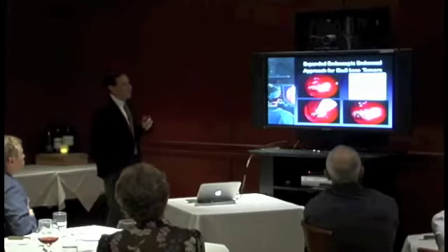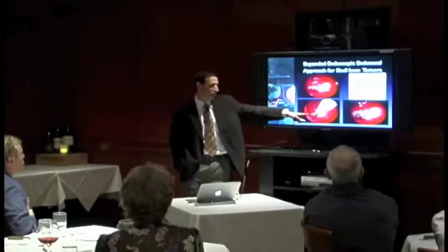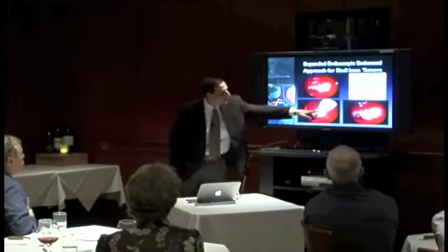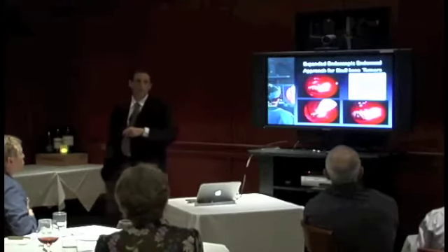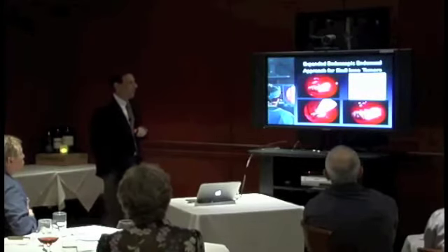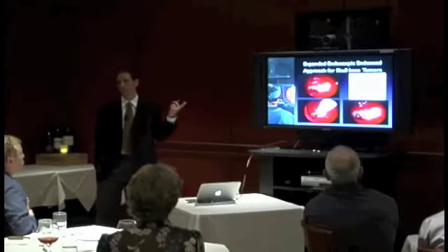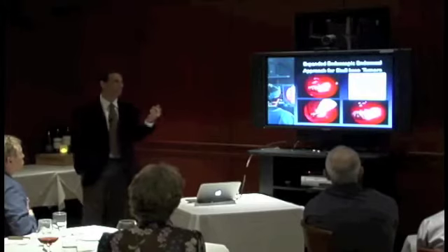This tumor actually, when we resected it, once you're done, you actually get some great views. Here we actually have our probe in the third ventricle. And if you look very carefully, these are the white structures on the bottom there. That's the fornix at the roof of the third ventricle. And then those are the septal veins that are sitting in the middle there. So with the endoscope, we've actually been able to get to the third ventricle. We've actually gone to the middle of the brain through the nose to remove tumors now.